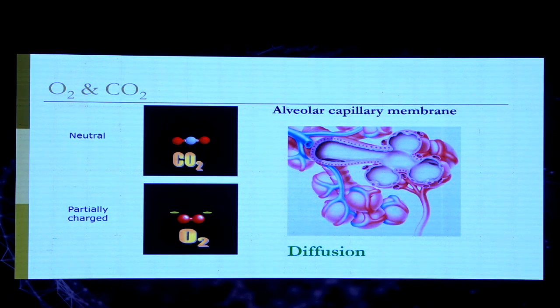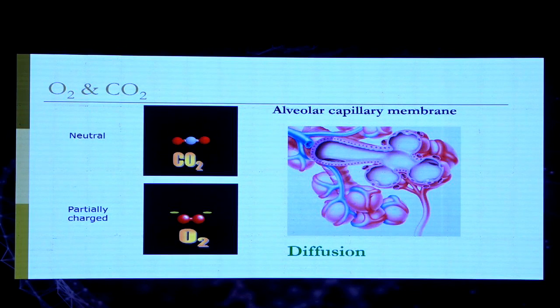That's easy. For oxygenation, you need pressure to push oxygen across the membrane. So you need a mean airway pressure and, of course, FiO2. So that's why they are different. In high frequency, it's easy. You have an FiO2, you have a MAP knob, and for CO2, you have a delta P knob and frequency.